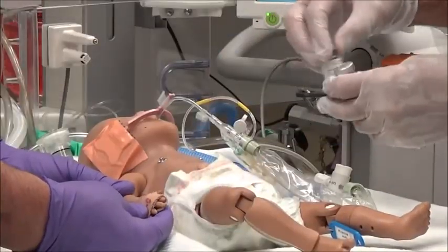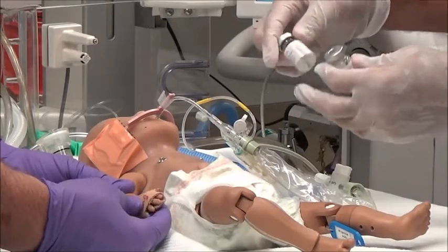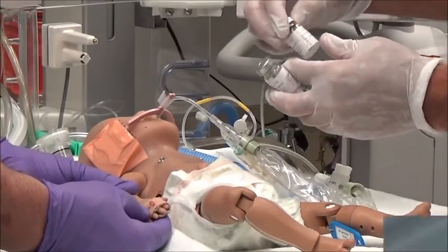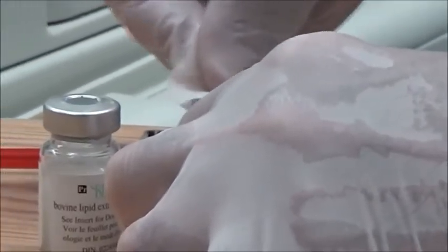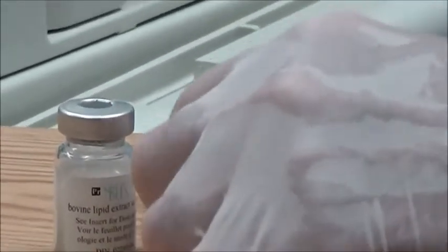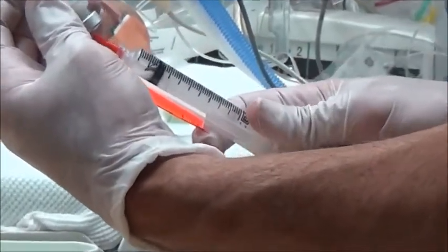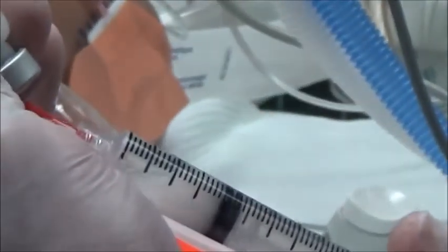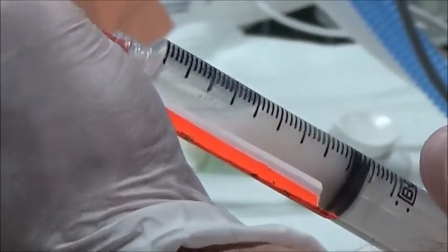Ensure the surfactant is warmed to room temperature as per manufacturer's recommendations. Remember, surfactant viscosity increases the longer it is warmed, which can potentially lead to complications. Check the expiry date and thoroughly clean the top of the vial as per policy. Draw up the surfactant, making sure that you add 1 ml of air.